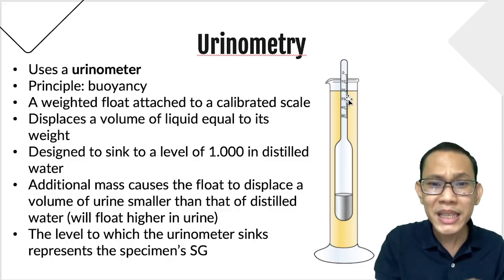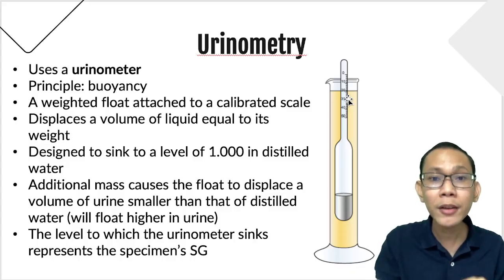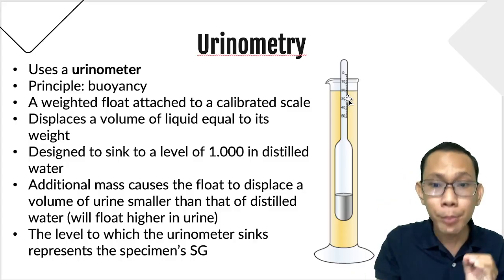So that is the basic mechanism of urinometry, based on density or buoyancy.